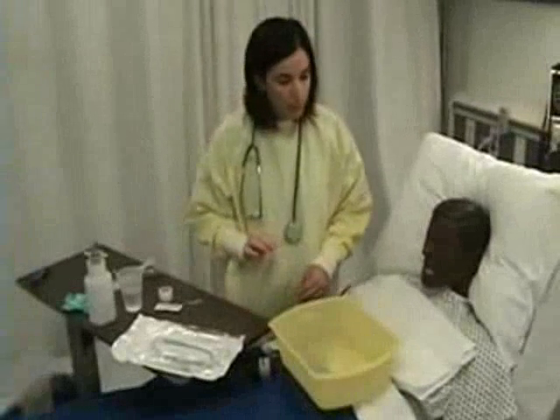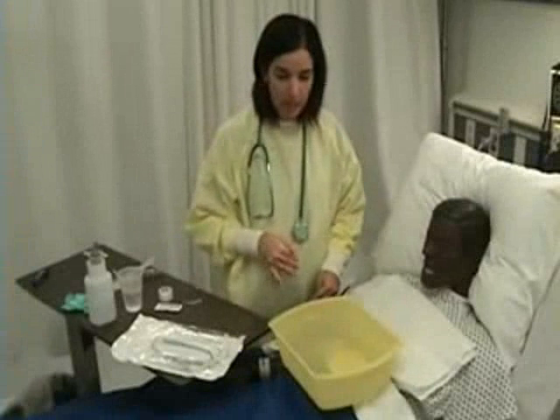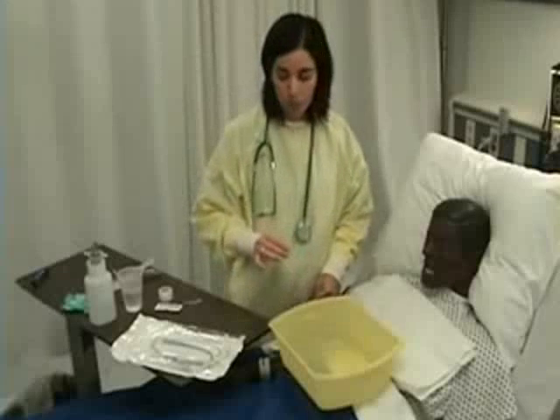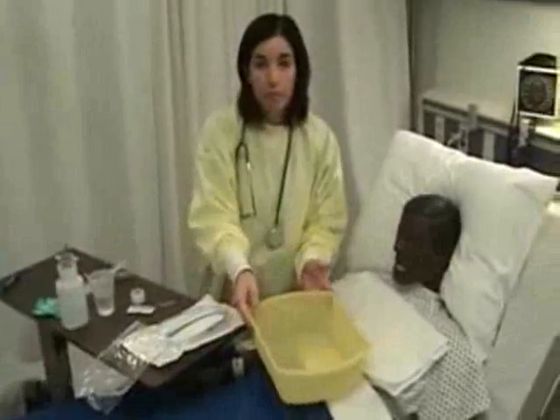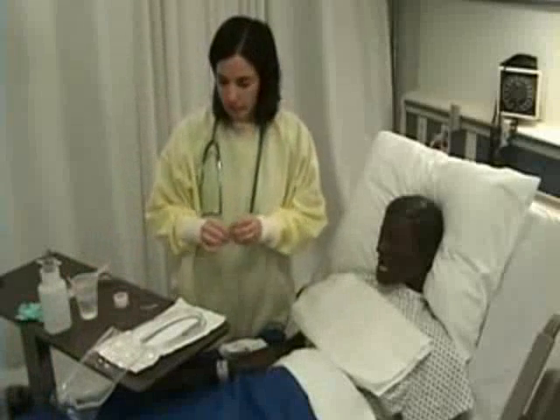I'm also going to ask my patient if he could take sips of water during the insertion of this NG tube, that will assist with passing the NG tube more easily. I will go ahead and open my tube, and I'm going to move my basin for demonstration purposes. And I'll open my lubricant.